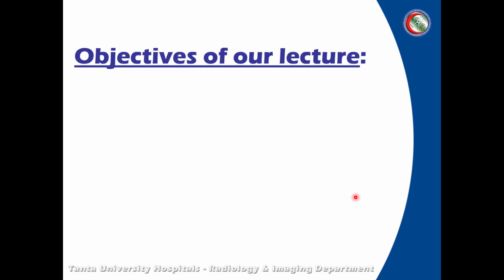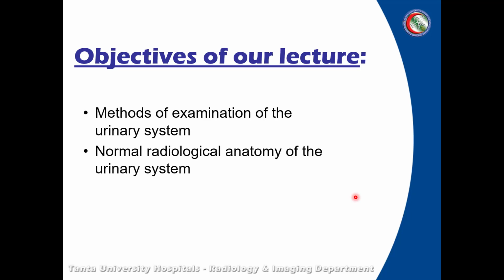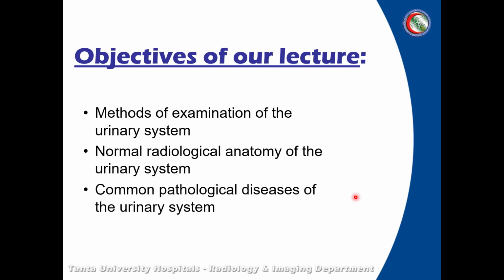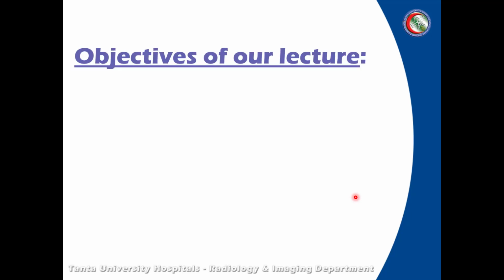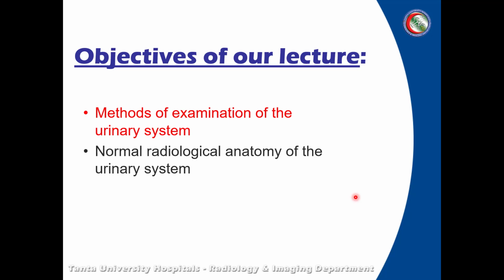At first, our objectives today: methods of examination of the urinary system, normal radiological anatomy of the urinary system, and common pathological diseases of the urinary system. Let's start with methods of examination of the urinary system.